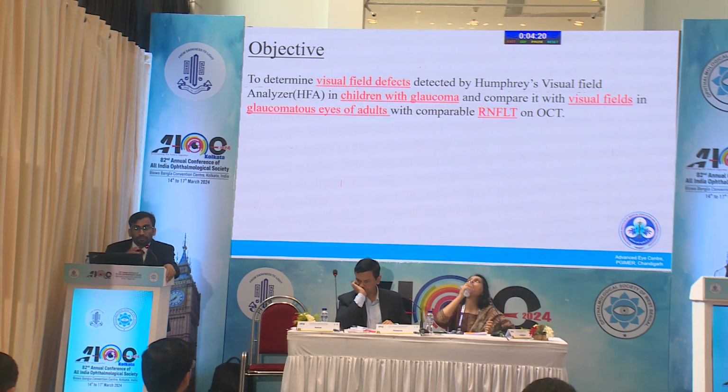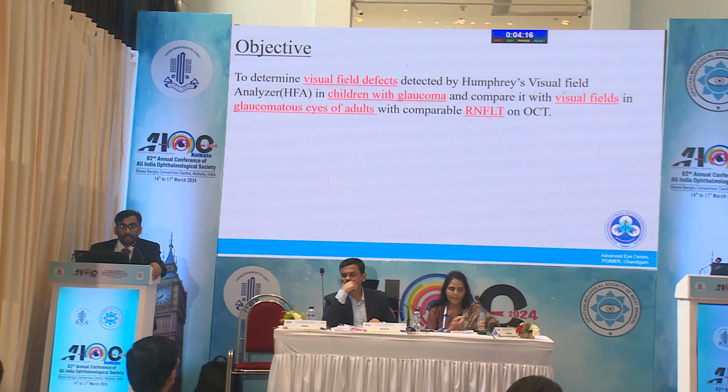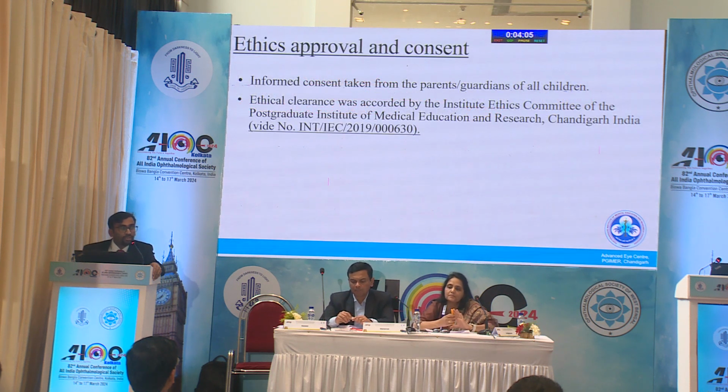With this background, our aim was to determine the visual field defects detected on the Humphrey visual field in children with glaucoma and compare them with adults with glaucoma with similar RNFL thickness. Informed consent was taken from the parents and the study was cleared by the Institute Ethics Committee.